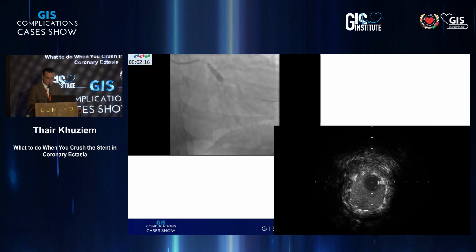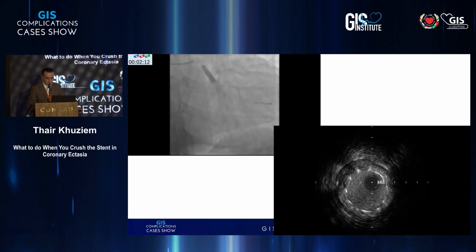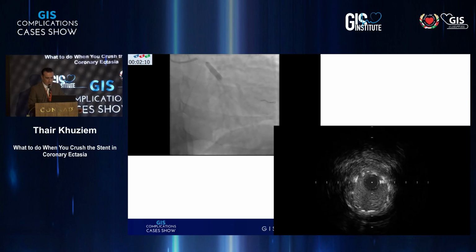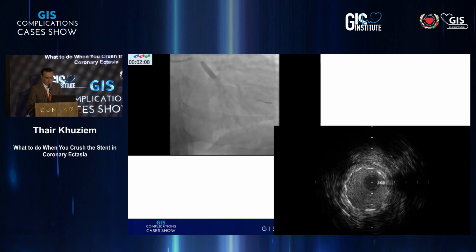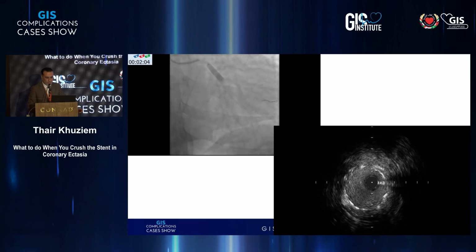Do I have time? Yeah, actually this is the last slide probably. I want you just to see that in the aneurysm we have good expansion now, or apposition.